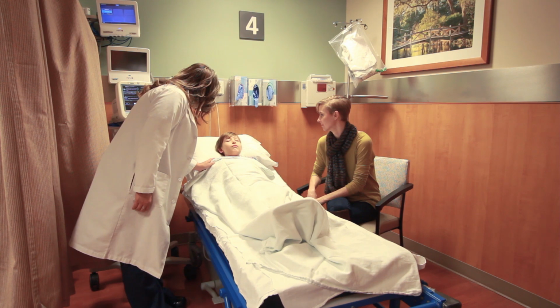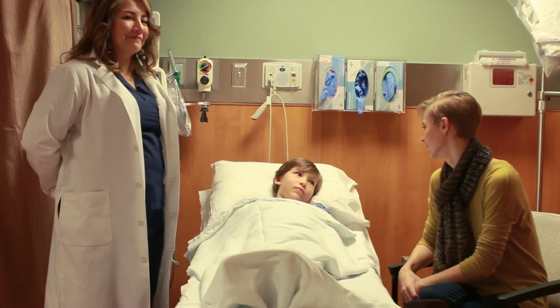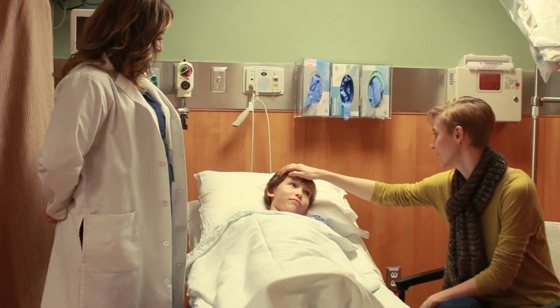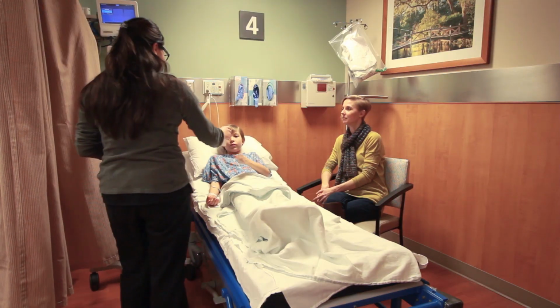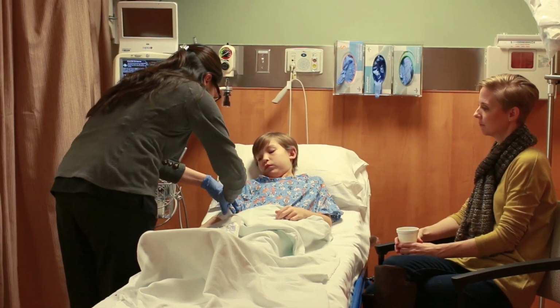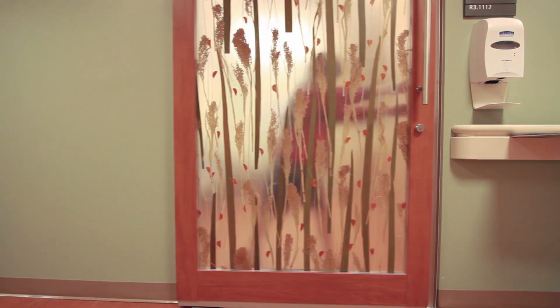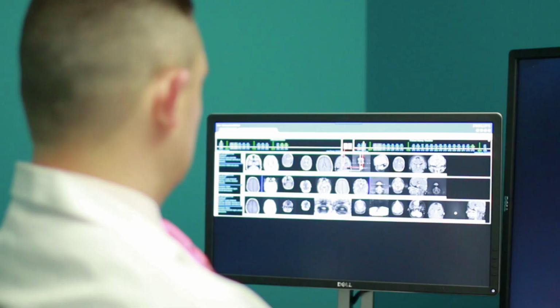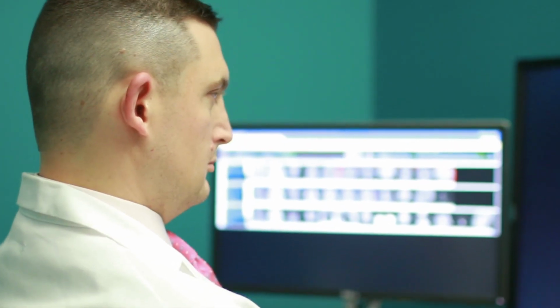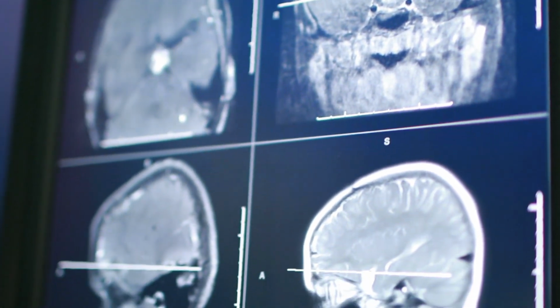When we are done taking your MRI pictures, the anesthesiologist will stop the sleep medicine and help you wake up. You'll be in a different room and your parent or caregiver will be there with you. After you wake up, you can have a drink of water or juice and something to eat. When it's time for you to leave, we will remove your IV tubes unless you have something else scheduled that day. Then you can change back into your regular clothes and leave. A special doctor called a radiologist will look at the pictures. This may take a little while, so you might not know the results on the day you have the MRI. When the results are ready, the doctor will talk to you and your parents or caregivers.